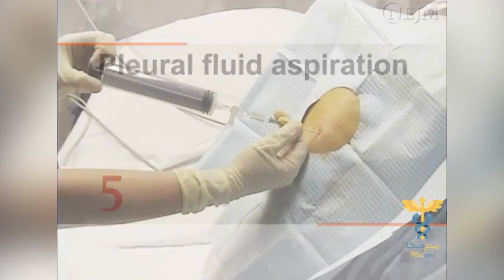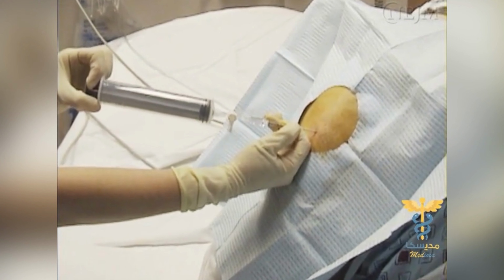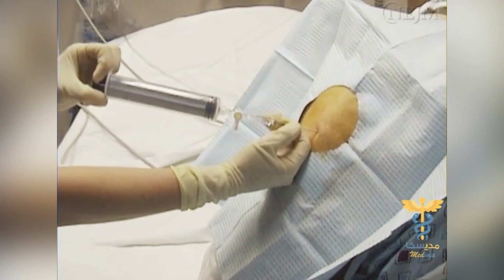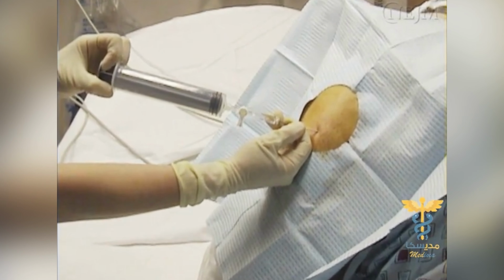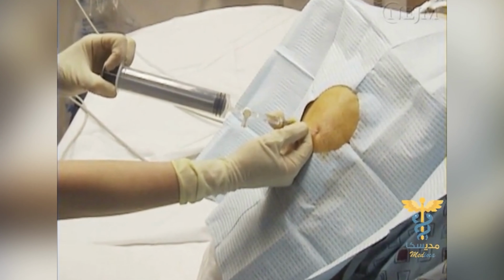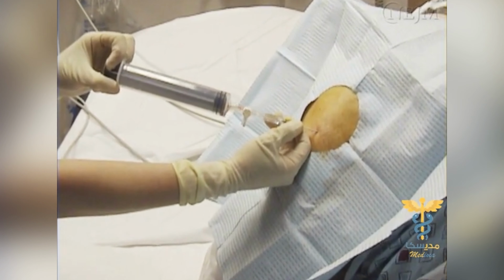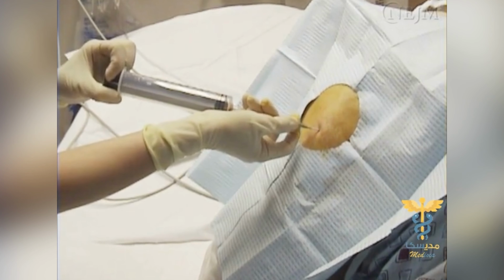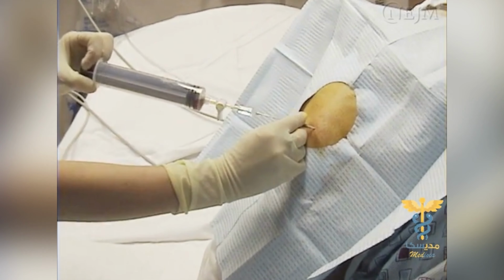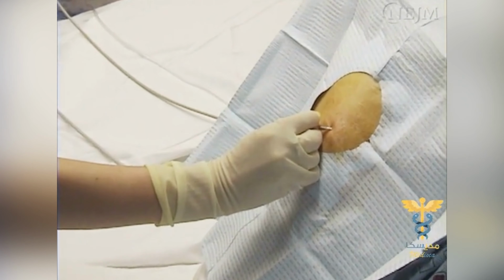Attach an 18 gauge over-the-needle catheter to a syringe and advance it along the superior surface of the rib. Keep pulling back on the plunger as you proceed to the predetermined depth of the pleural space. Once fluid is aspirated, immediately stop advancing the needle and guide the plastic catheter over the needle. When the catheter is fully inserted, remove the needle as the patient exhales or hums.